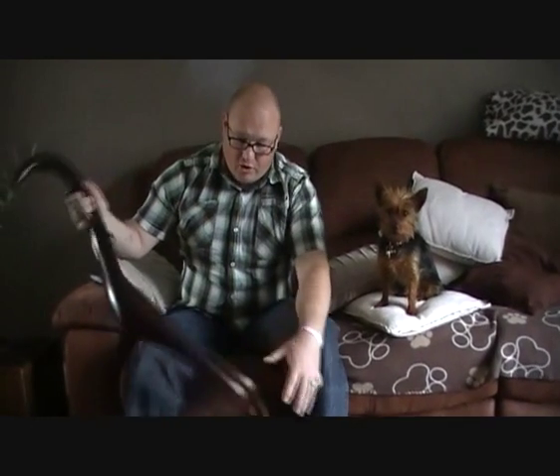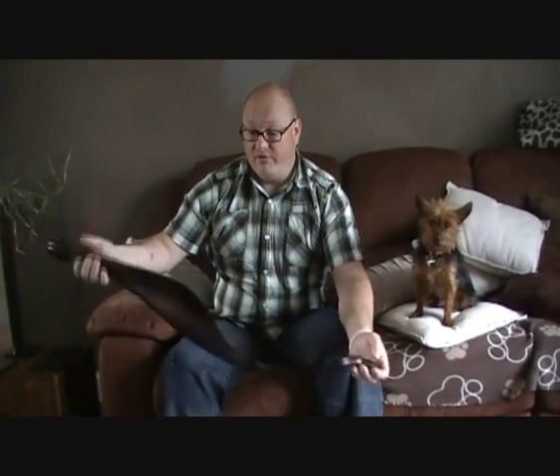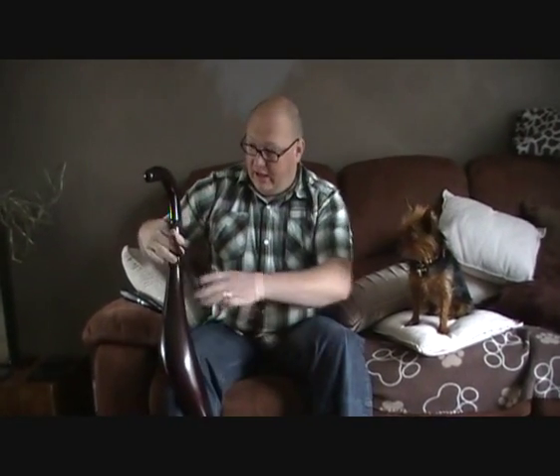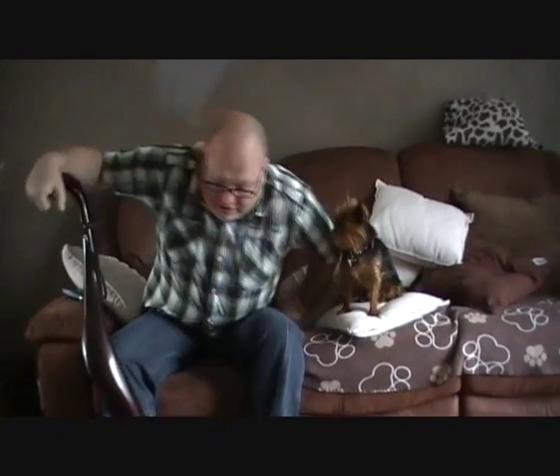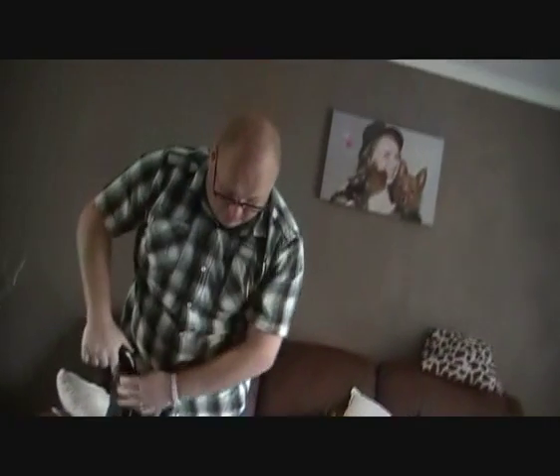You look at it on the website and you think it's going to be very chunky, very heavy, but it's very lightweight, quite snazzy, and I've only been using it a short time and it's quite easy to get used to straight away.